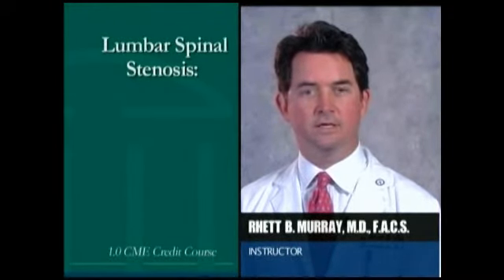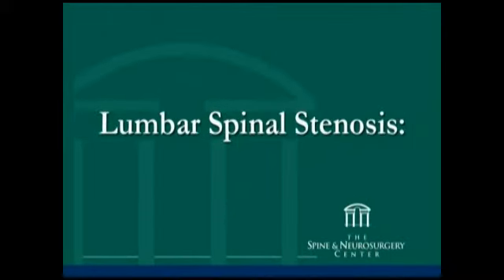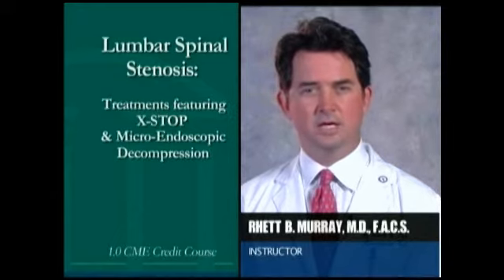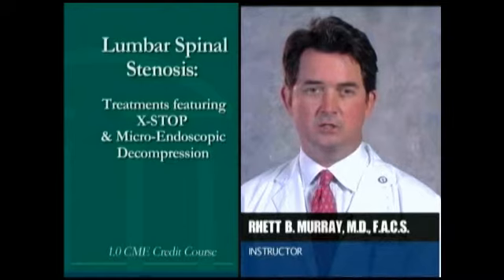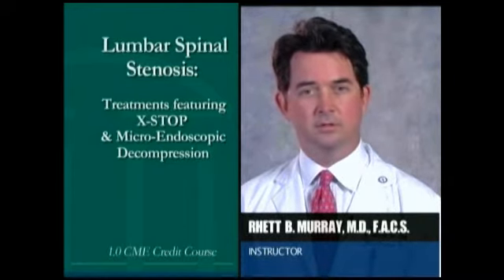Today we're going to be earning CME credits discussing lumbar spinal stenosis, the ways to identify this condition through exam and radiographic assessment. We're also going to be discussing treatment options, including a new minimally invasive technique for decompressing the spine, as well as the X-stop, which is a spacer for the lumbar spine, which does no damage to the spine and opens up the spinal canal with minimal disruption of the soft tissues.